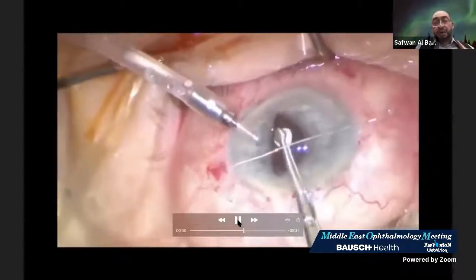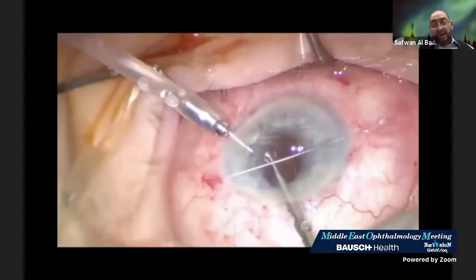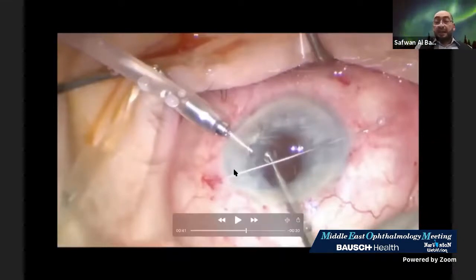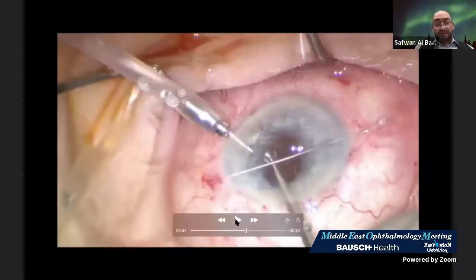See now this maneuver. See how here he pushed toward the left side, and in this way I went down, because I'm a very curious person. I went down when I did it, and I saw that on the left side I created trauma to the ciliary body and to the peripheral part of the retina. That's why I stopped using it.